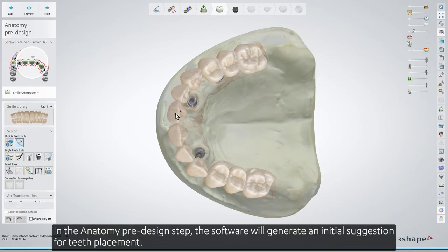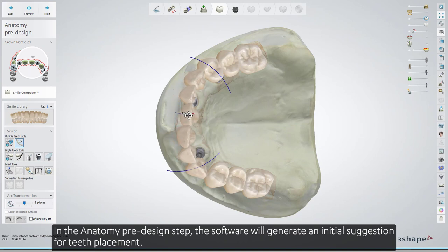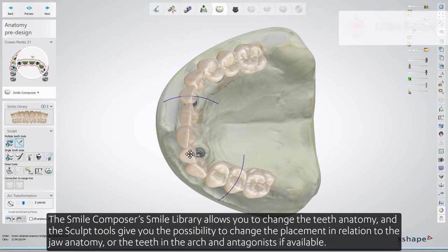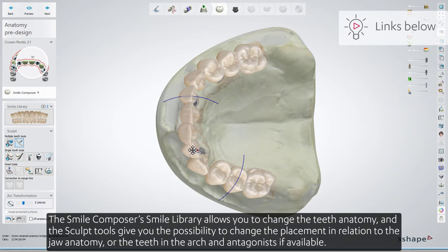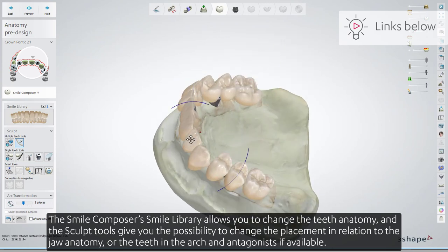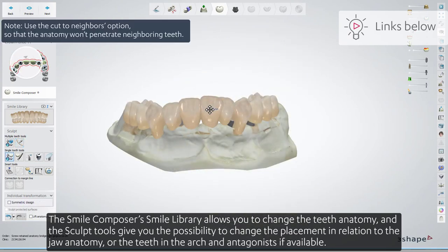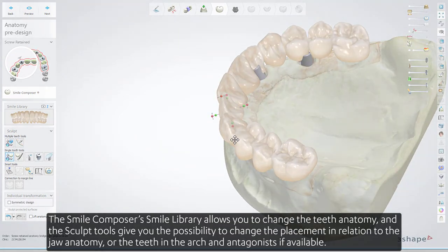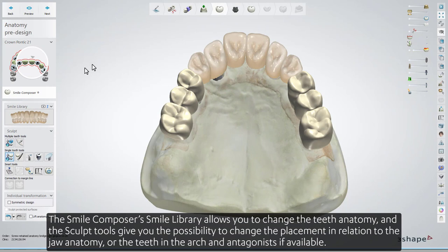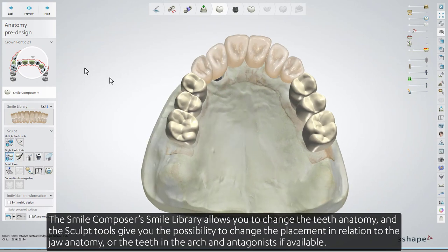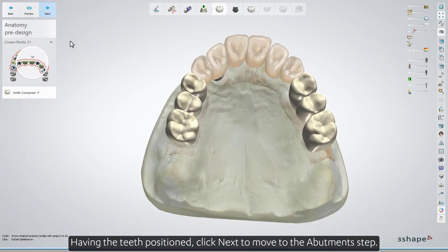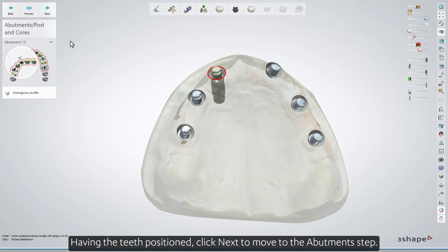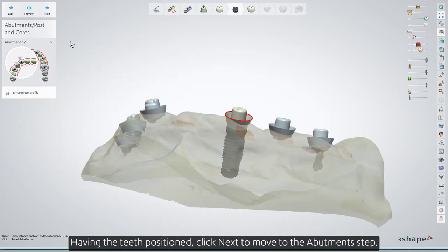In the Anatomy Pre-design step, the software will generate an initial suggestion for teeth placement. The Smile Composer's Smile Library allows you to change the teeth anatomy, and the sculpt tools give you the possibility to change the placement in relation to the jaw anatomy, other teeth in the arch, and antagonists if available. Having the teeth positioned, click Next to move to the Abutments step.